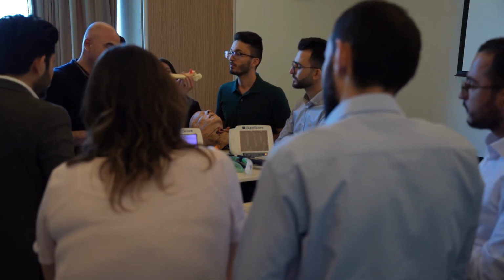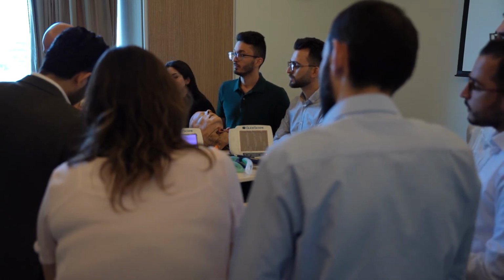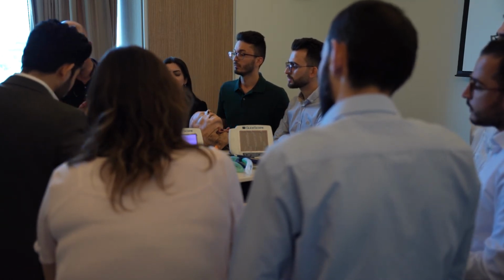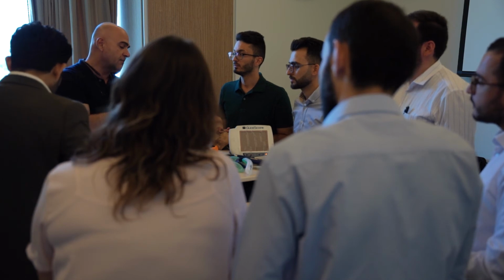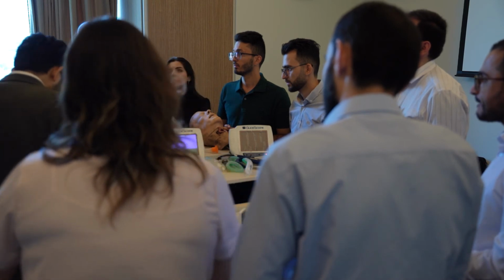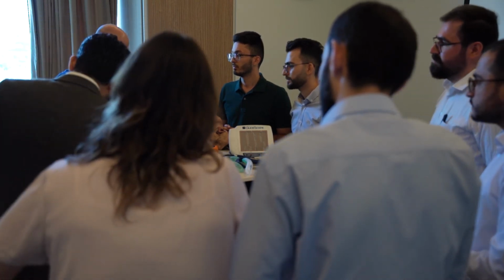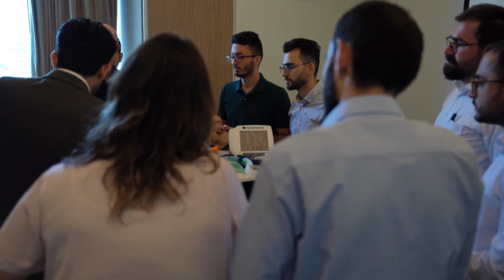This is ready for use. You can use everything that you consider for intravenous, okay? You can aspirate blood for every test, but label the tube as from the IO. You can give blood, fluid, everything. If the patient is conscious, they need local anesthesia. If conscious, you should give local anesthesia, lidocaine, okay, good.